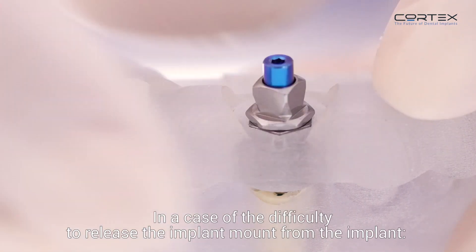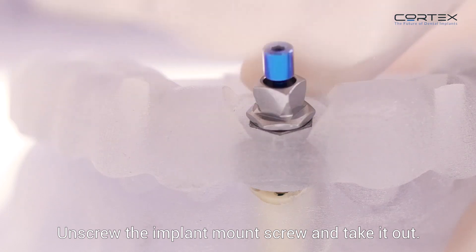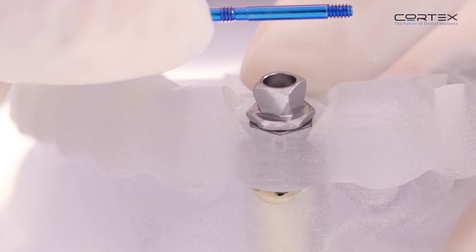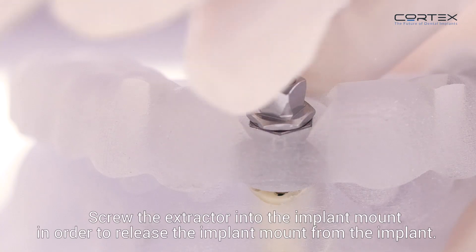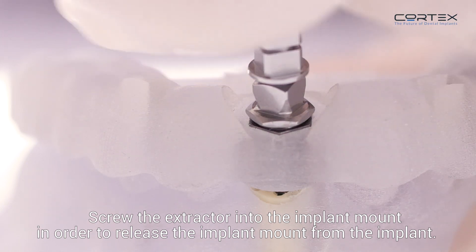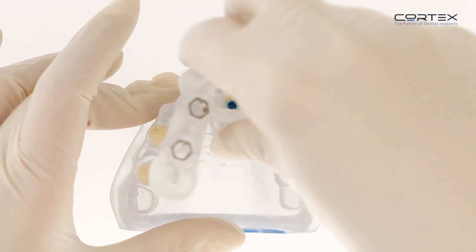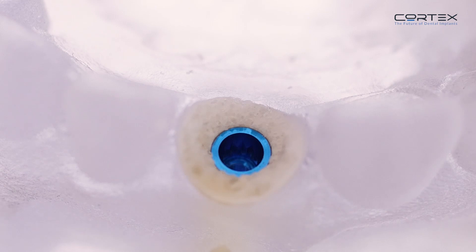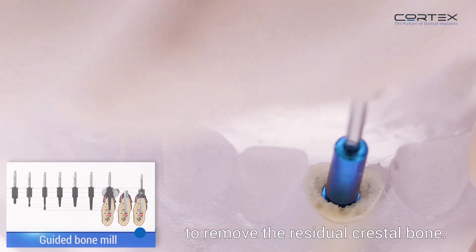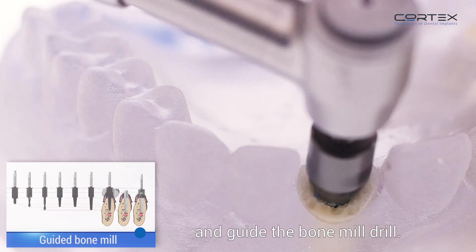In case of difficulty releasing the implant mount from the implant, unscrew the implant mount screw and take it out. Screw the extractor into the implant mount to release it from the implant. Do not apply torque more than 15 newton centimeters. After removing the surgical guide, use the guided bone mill to remove the residual crestal bone, and place the safety screw to protect the implant and guide the bone mill drill.